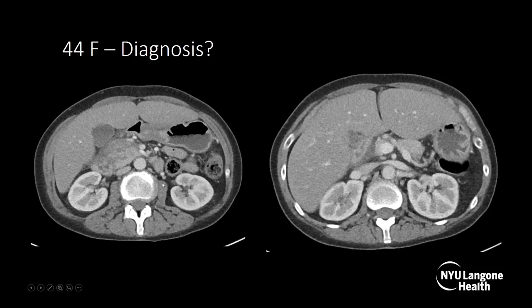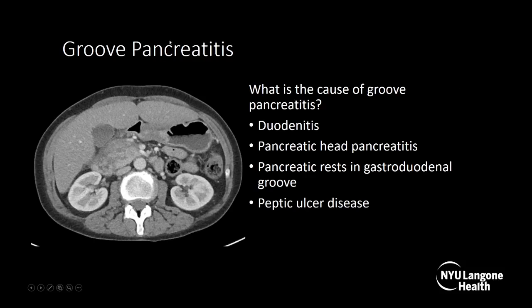This is a 44-year-old female with an axial CT with IV and neutral oral contrast. The body of the pancreas enhances completely and looks normal size with no peripancreatic fat stranding or fluid. But in the head, there's heterogeneity and some edema — it's a little bit enlarged — with fluid extending into the pancreaticoduodenal groove and fat stranding. This is an example of groove pancreatitis.